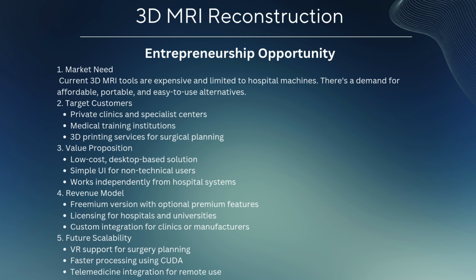Our target customers include private clinics and specialist centers that don't have access to advanced imaging tools. It also caters to medical schools and training centers where interactive 3D anatomy models can enhance teaching. Additionally, 3D printing services can use this application for surgical planning and creating physical models.